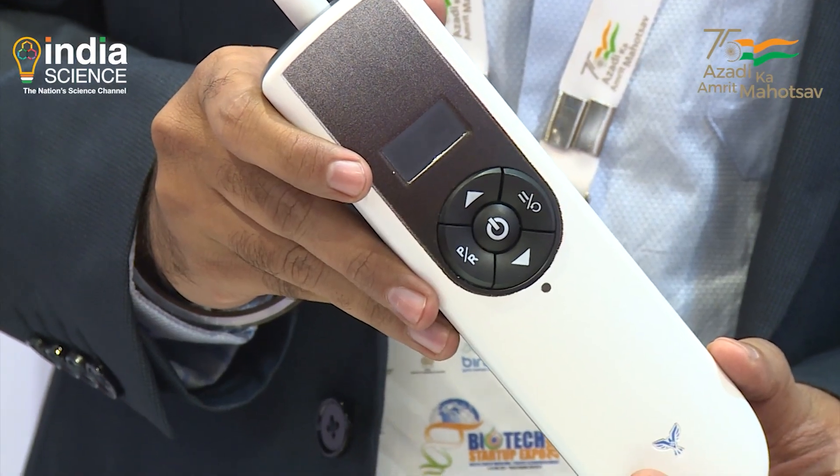This is a very innovative product — a neuropathy screening device for foot neuropathy. Nishant will speak on the details of this product.